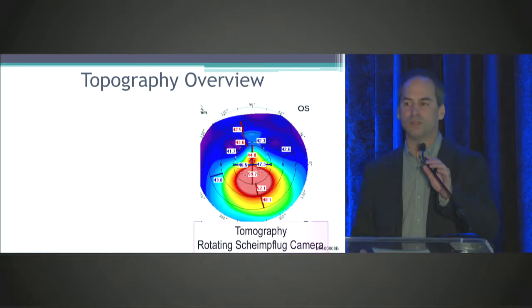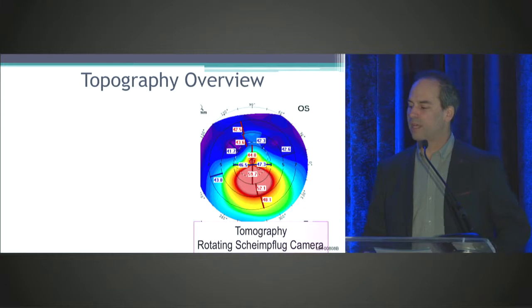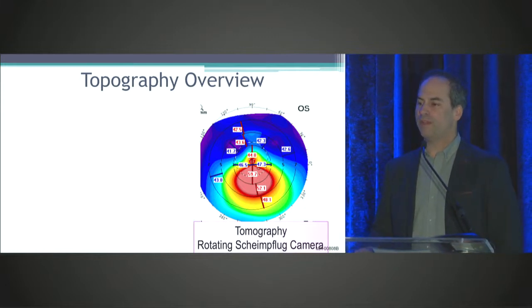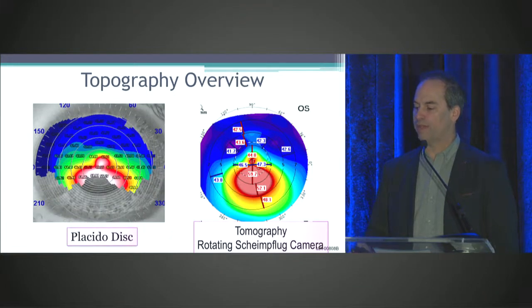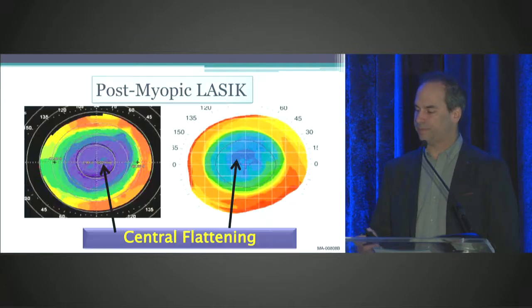For keratoconus, one of the key things that I learned quite early is that with tomography, you can image very steep corneas, which is critical for evaluating patients with keratoconus. Here's a patient of mine where we can get a nice image of the cornea with tomography, but look at the Placido disc. If you only have this in your practice, it really won't be possible to follow this patient for either progression or, after cross-linking, improvement or changes in their corneal shape.